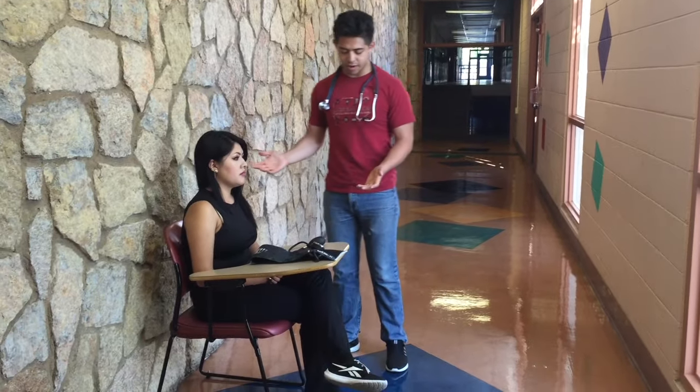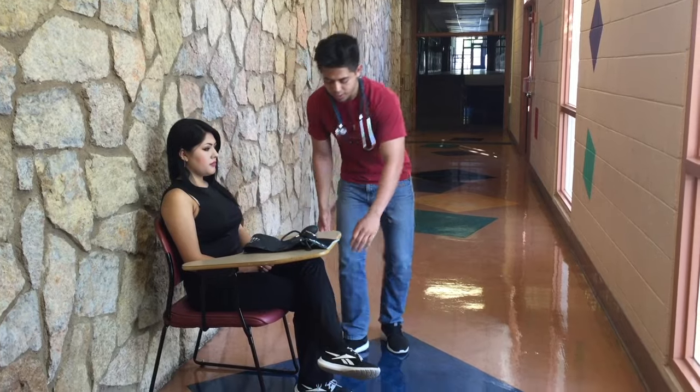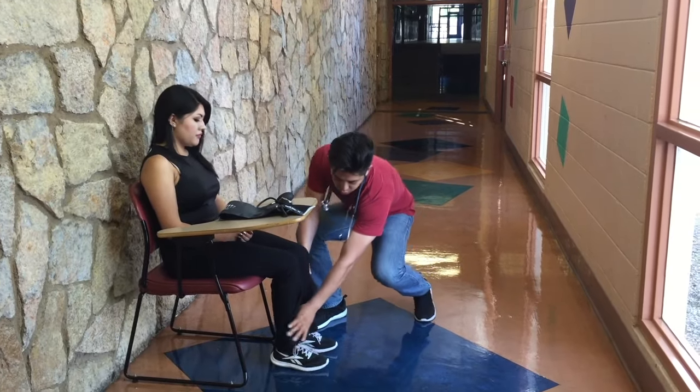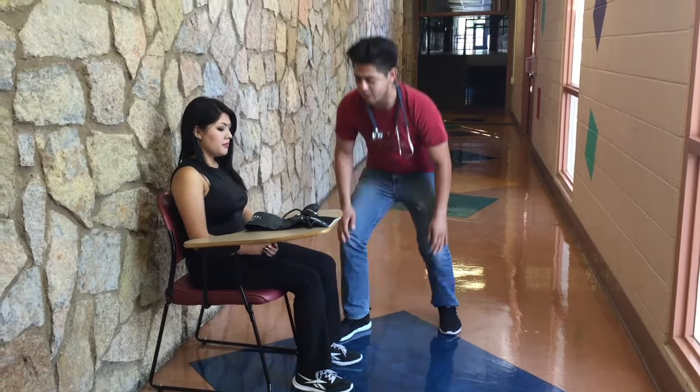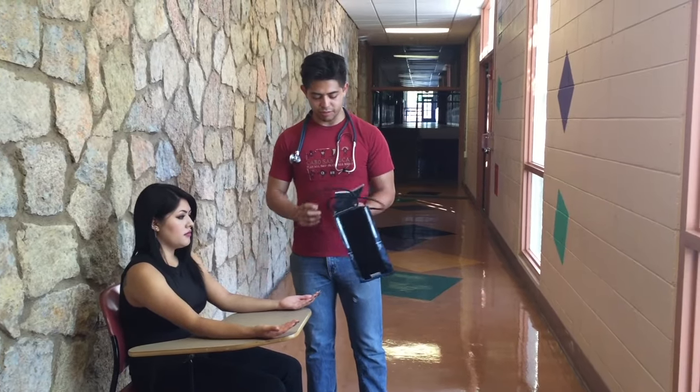You want to sit them down with their back completely straight on the chair, supported. You want to make sure that the feet are shoulder width apart and flat on the ground. You want to make sure that the arms are supinated and at heart level. We're going to take the blood pressure on the left arm.